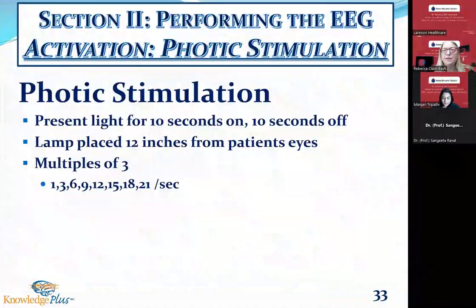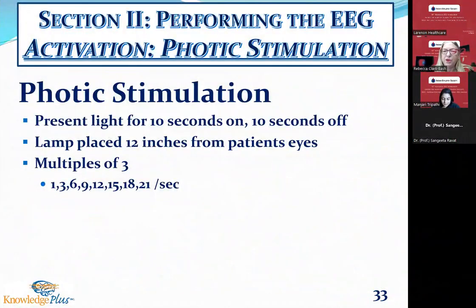Hyperventilation. So that's the end of the module on hyperventilation. And again, I want to stress how important it is to take your children all the way to 5 minutes. And who do I consider a child? I will use the traditional, anybody 18 or under, I would perform that on, because the child might be out of the age range of onset of absence, we can't be absolutely sure of that unless we push our activation procedures to the bridge, to the end.